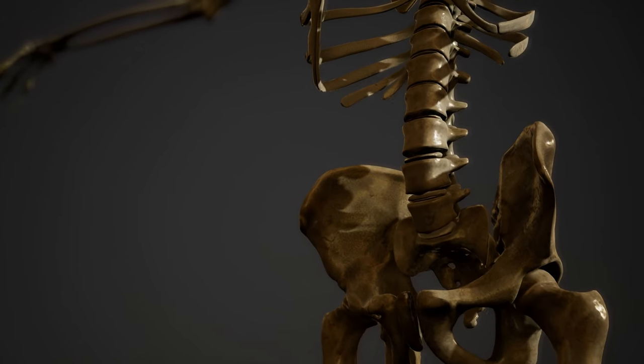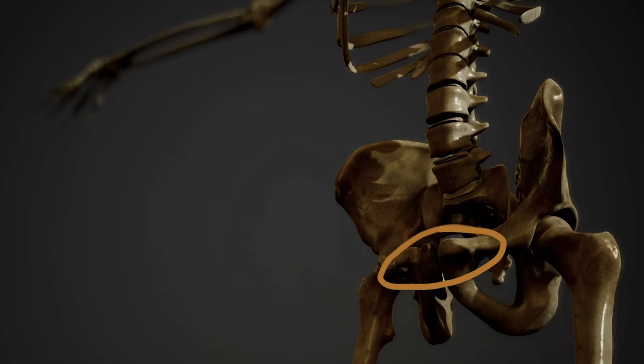Unfortunately there's not a lot we can do for internal bleeding in the pre-hospital setting, but applying a pelvic binder is one way to stabilize the pelvis to minimize the chances of severe bleeding. Applying one early in your treatment of a traumatic patient can be very beneficial. The weakest part of the pelvis is the pubic bone, in front and on the bottom of the pelvic girdle, though fractures can happen in several different places.